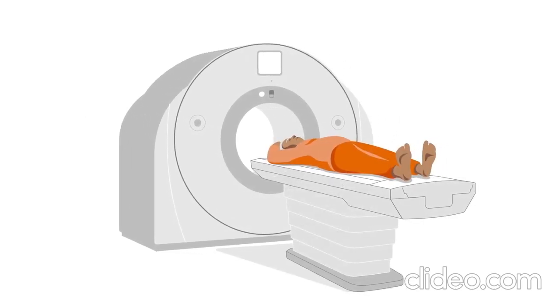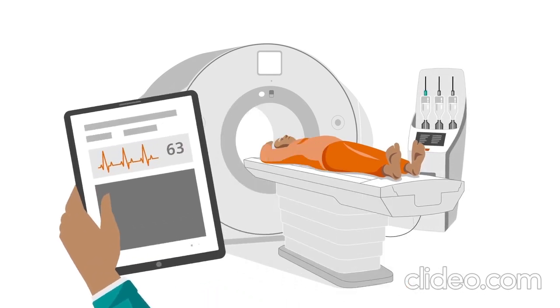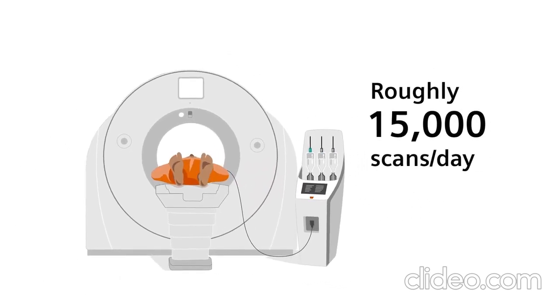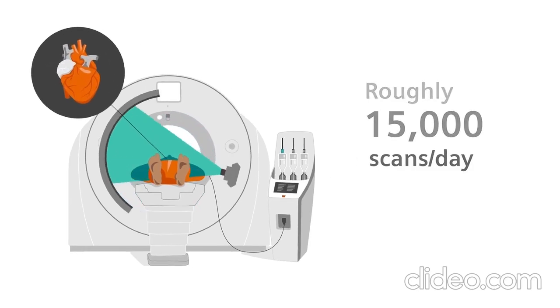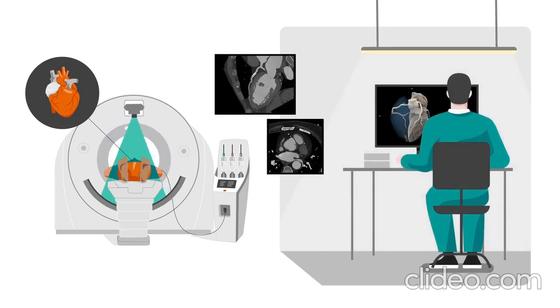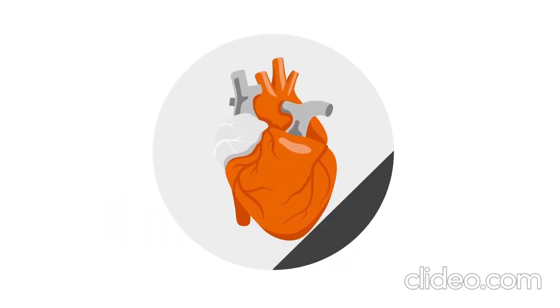Since its inception at the end of the 1990s, the coronary CT angiography, or coronary CTA scan, has become a valuable tool for radiologists and cardiologists around the world. Around 15,000 of these scans are performed each day worldwide. It displays the coronary vessels of the patient in high detail and allows an evaluation of the lumen, stenosis, coronary plaque, and many other cardiac pathologies.